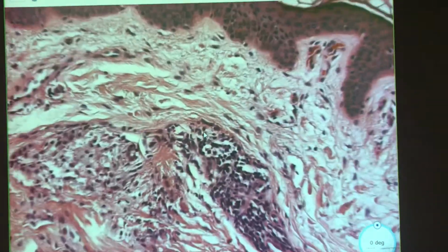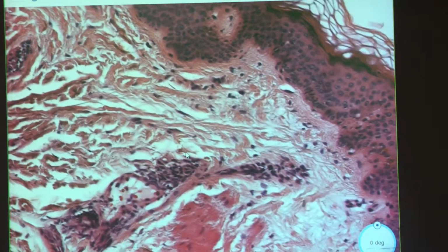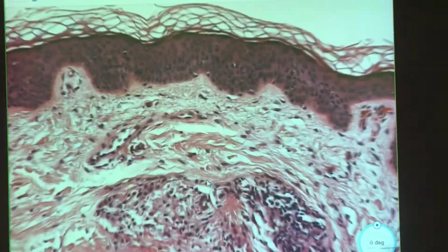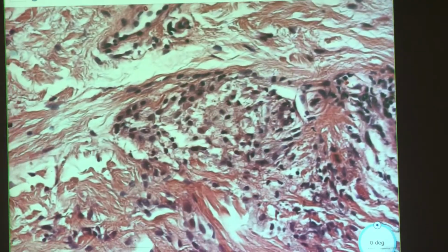Well, if there are examples, it's probably because it's a very prolific tumor. So again, this one's not as crazy, at least in that patch there, as the previous one, but I feel like there are some more of those foamy, maybe not this one, the other one I saw like a better example. Let's go back. This one here, this group here looks a little foamy, sort of. Okay.